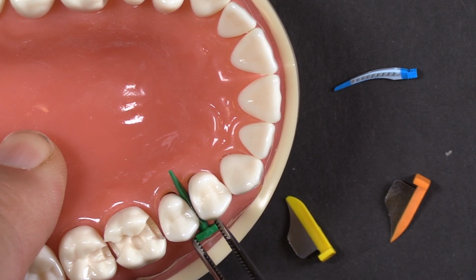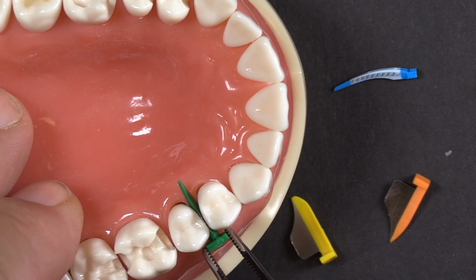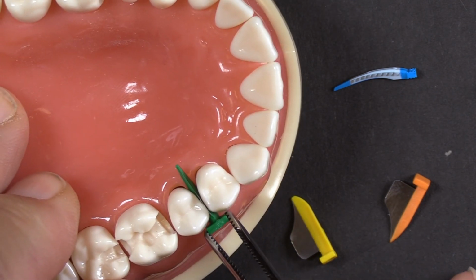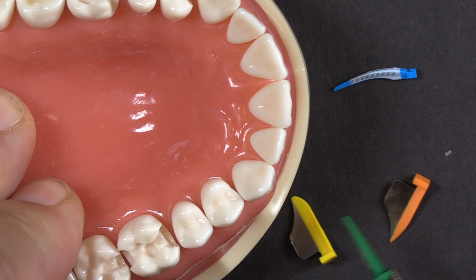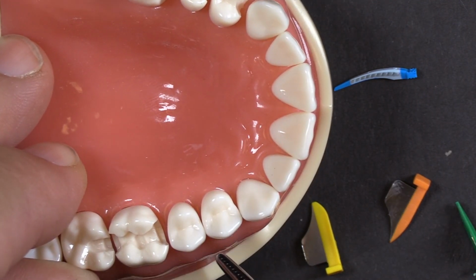And by having it wedged more firmly, you're going to create the necessary separating force to loosen those ligaments a little bit, so that when you remove the fender wedge, you should hopefully have enough space then to slide the band in.